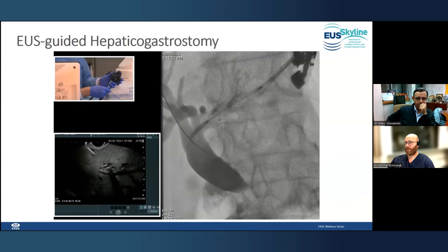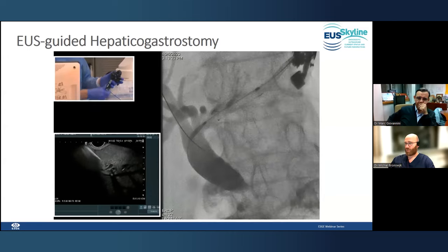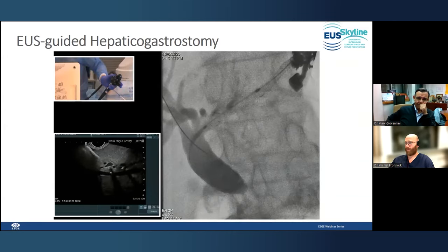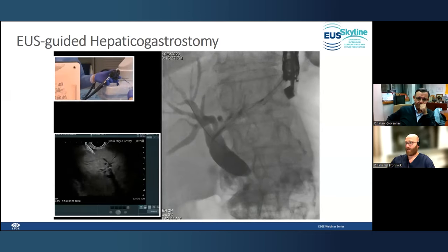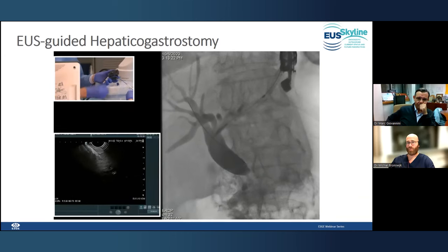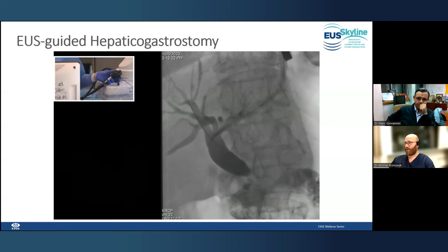What really is important here is to use traction. So what we do is we stop for a second. That's what we're going to do now. Zoom out a little bit and then move ourselves towards the esophagus a little bit and use continuous firm traction and intrascope release. This is what you see happening here. We're bridging the peritoneal space and then the stent is deployed.